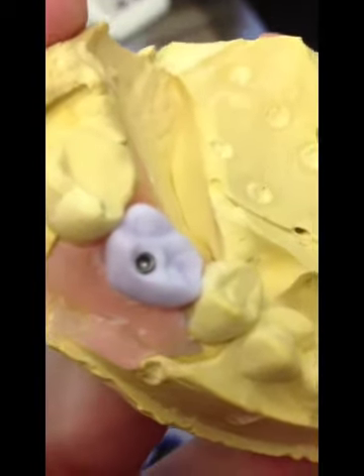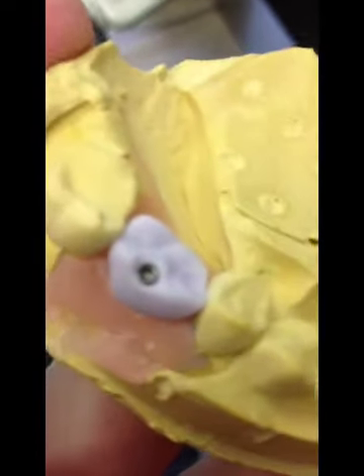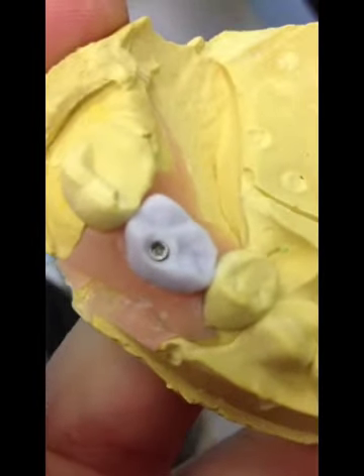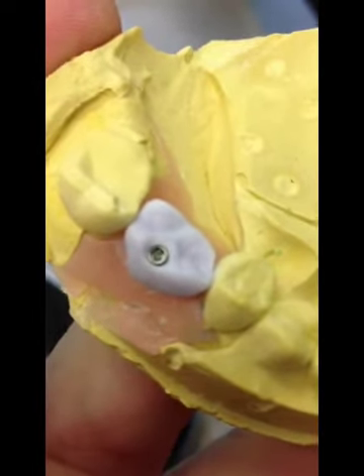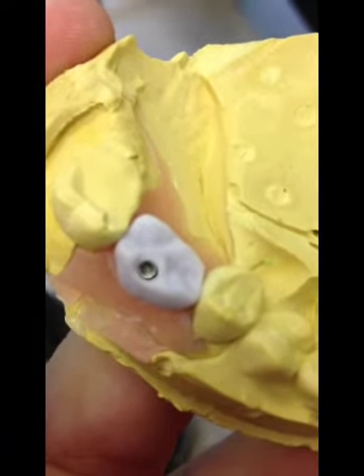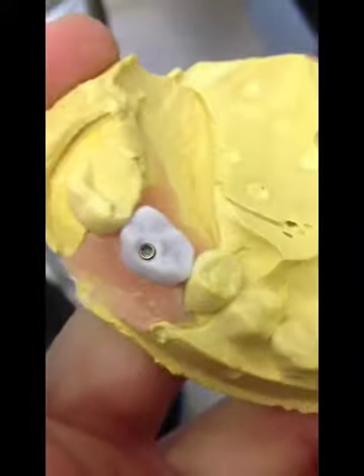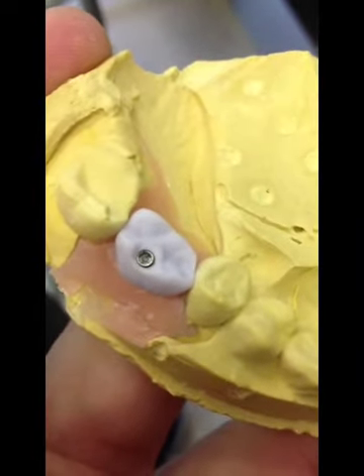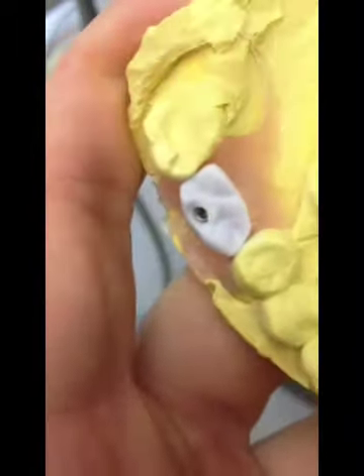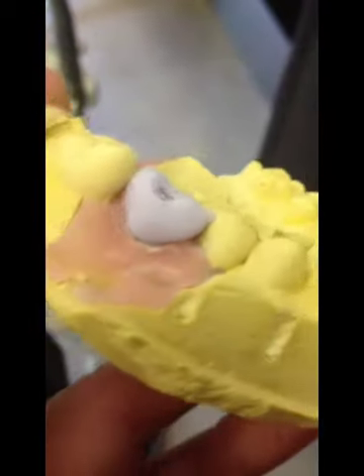And here's what it looks like on the cast. Okay, so you can see that screw is coming right out, and I will say these words of warning. If you don't have a direct path of insertion here, then it's going to be really difficult for you to get this thing seated. In fact, this method is not going to work, and so then you're going to have to go to the lab and everything. But this checks out. We're able to get this seated down here.